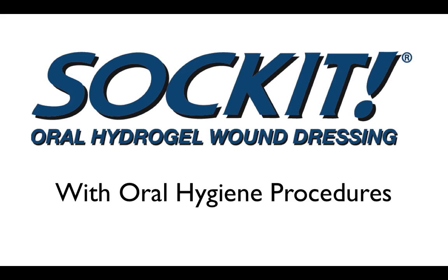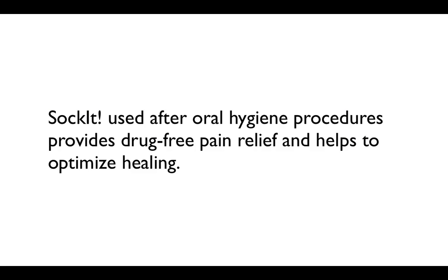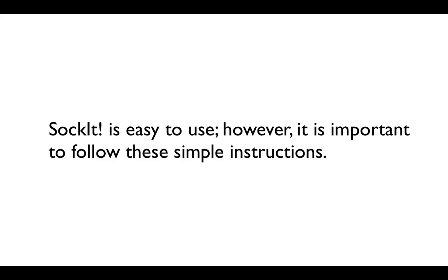Socket Oral Hydrogel Wound Dressing with Oral Hygiene Procedures. Socket, used after oral hygiene procedures, provides drug-free pain relief and helps to optimize the healing process. Socket is easy to use; however, it is important to follow these simple instructions.